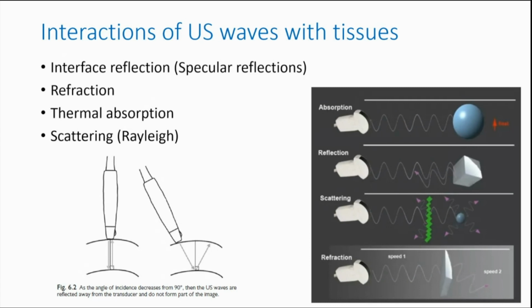Reflectivity is said to be greatest when the tissue or the object to be visualized lies perpendicularly to the axis of the ultrasound beam. Apart from that, some of the ultrasound waves that are not reflected may be refracted instead, and this can be seen in almost any tissue medium, but is more commonly seen especially in fatty tissue or when the transducer probe is being angled. So this will cause poor visualization of the object being visualized.